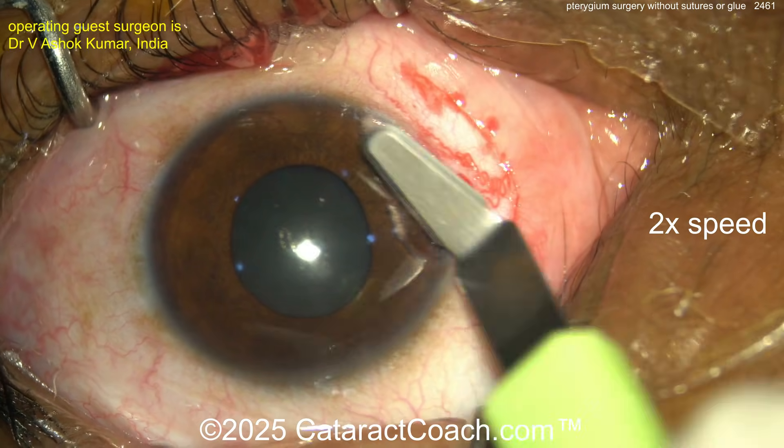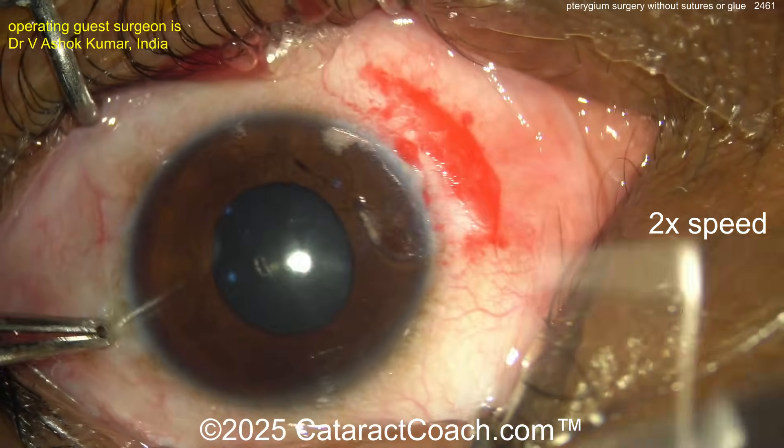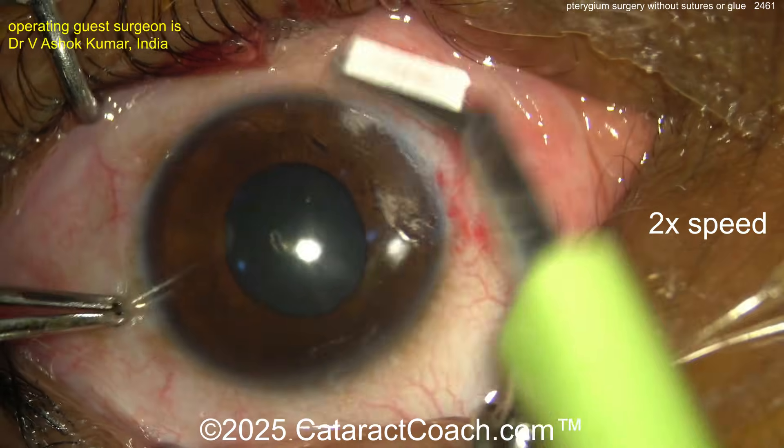Now using a crescent blade here to smooth off the cornea — be gentle, don't go too much.